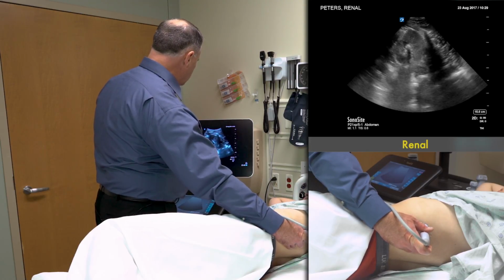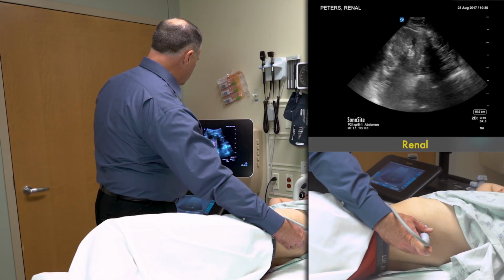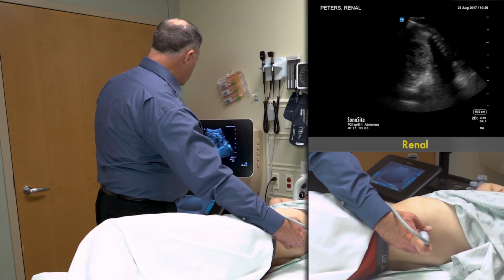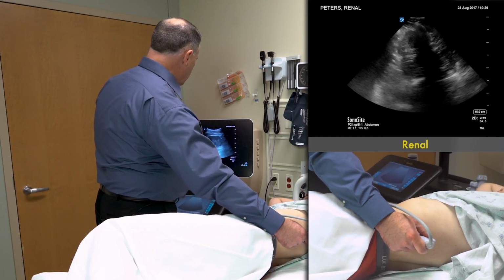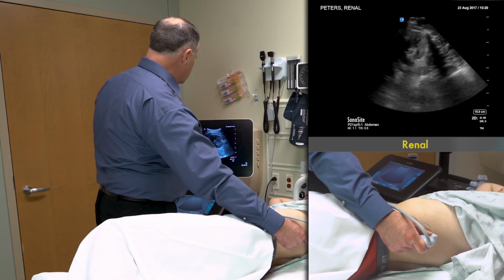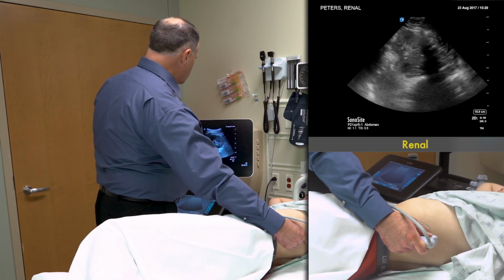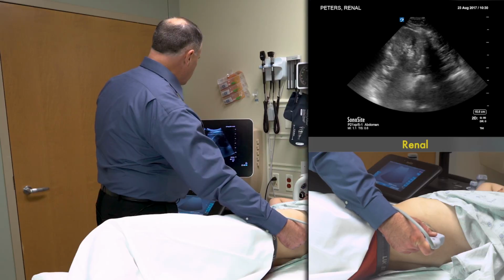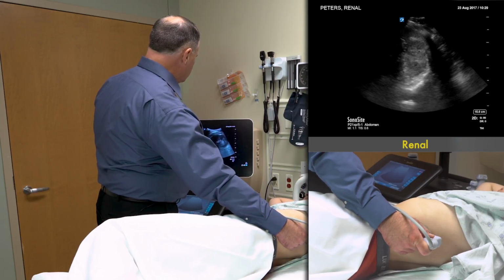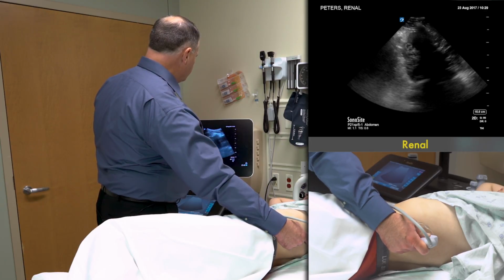And we can again place color Doppler where we can see the vessels due to their flow. So again, I typically image in the long axis to initially evaluate for hydronephrosis, and I turn in the short axis to scrutinize what the medial collecting system looks like. If I move more superior, then I bring the spleen into the image over here on the top or the left of the screen. And again, that's a healthy appearing kidney without hydronephrosis.